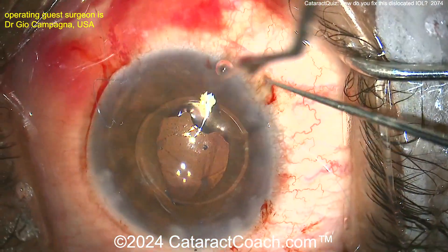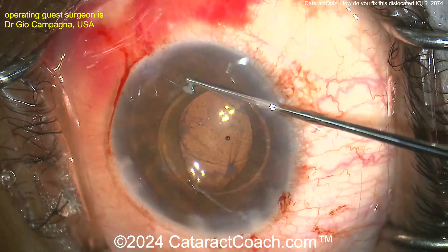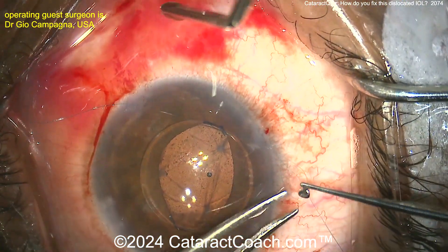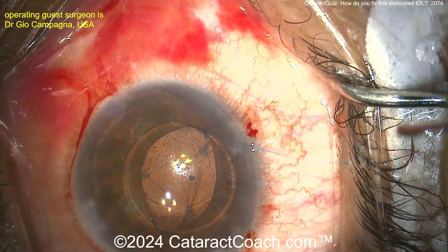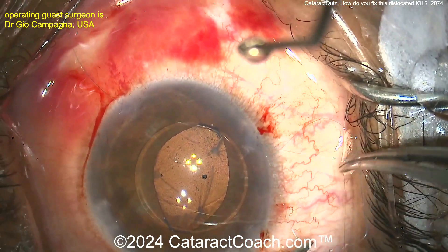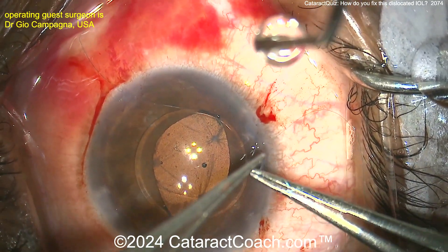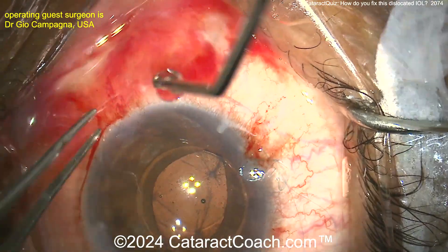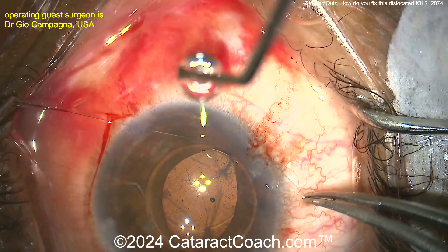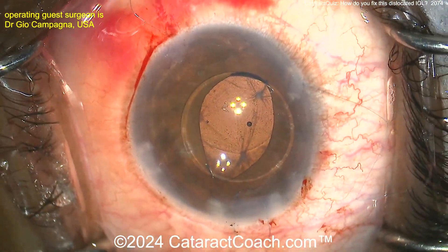Tying up the suture here — you can see how it's placed where the haptics are now behind the iris and the optic is in front of it, keeping the optic stable. Once these sutures are tied and secured, you can gently push the optic back behind the iris. That's going to go in pretty nicely. Do you need to have a peripheral iridotomy for these cases? In general, no, but it probably wouldn't hurt to do a small one.